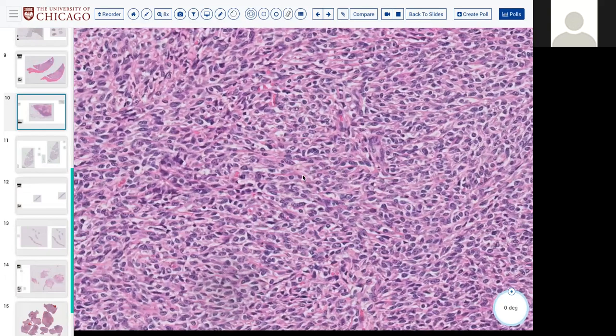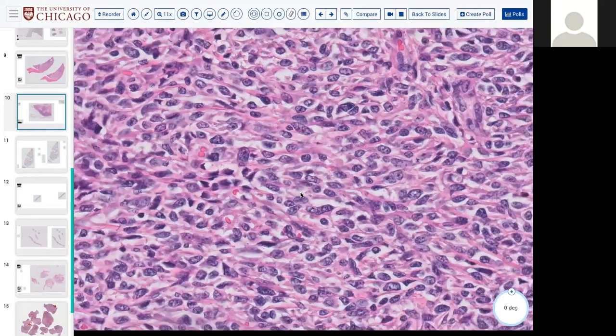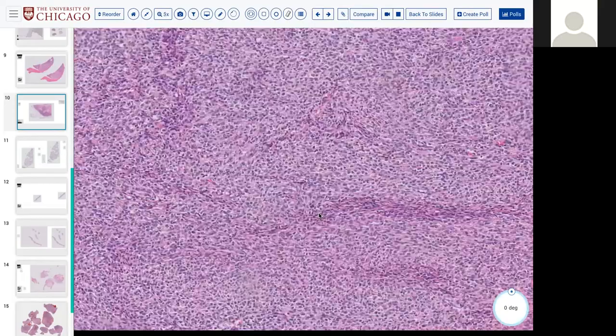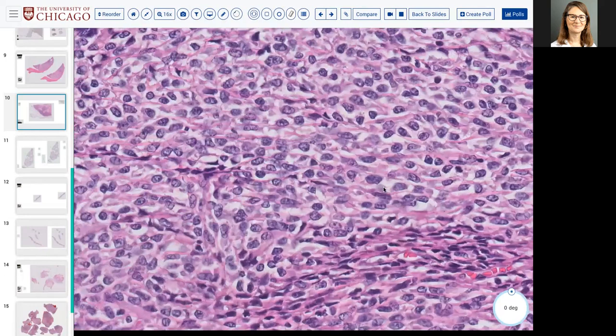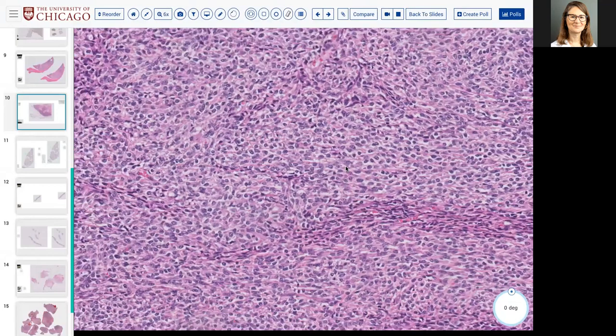Riham, did you want to go with your MPNST? I mean, RB would be the classic for myofibroblastoma. Again, this just sort of reminded me of what we saw with Dr. Kraus, but I don't necessarily think that that's the best choice. Got it. That's a good point in as much as there is morphologic overlap between a lot of soft tissue tumors, and myofibroblastomas can have this sort of monotonous cellularity, this linear arrangement. But arguably, maybe the nuclei in a myofibroblastoma are less plump. And yes, you would expect loss of retinoblastoma, which this does not have.